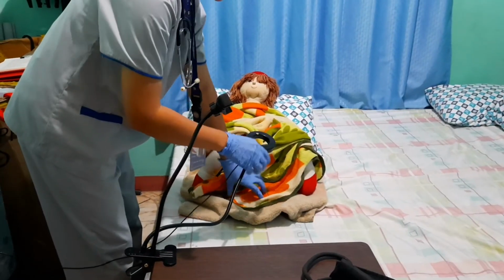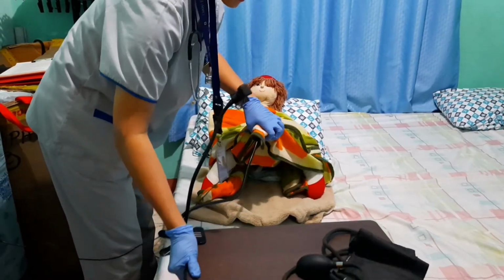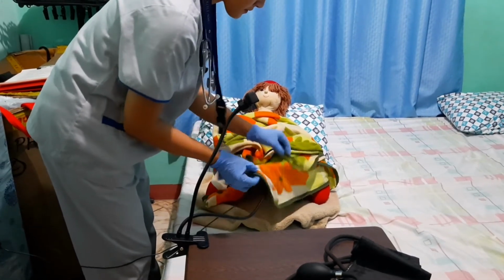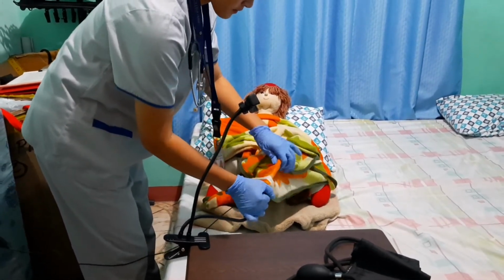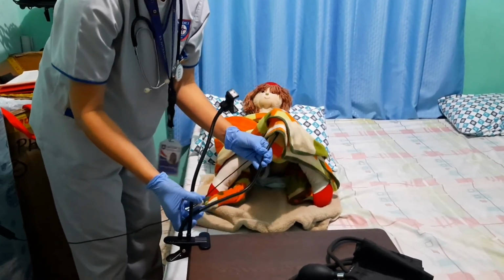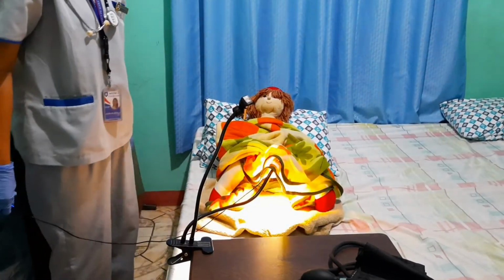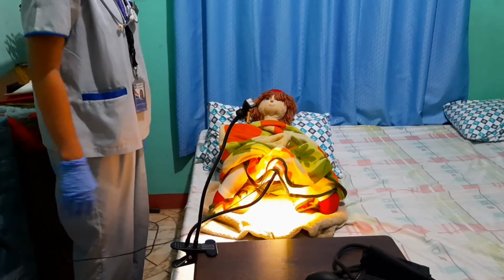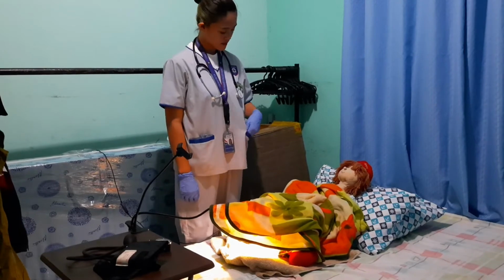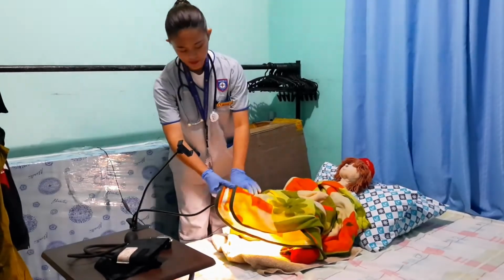And after we do the diamond draping, we have to position the Perilight at least 18 inches away from the perineum, and with the Perilight in place, drape accordingly. And you also have to instruct your patient to prevent unnecessary movements. And you also have to stay with your patient all throughout the procedure. And every 5 minutes, you must ask your patient if she is feeling any numbness or any sensation.